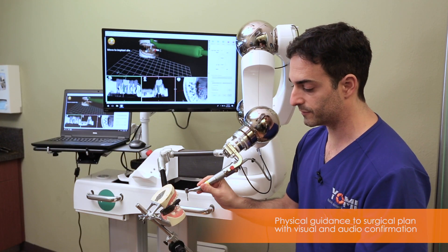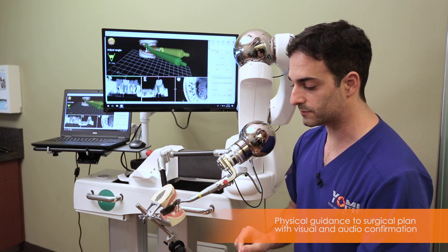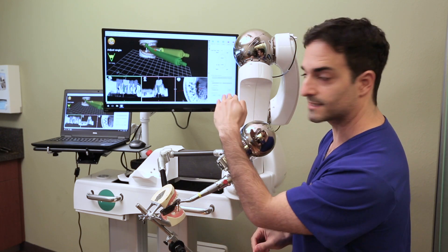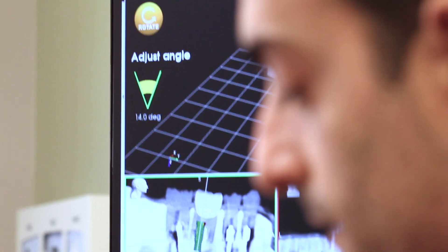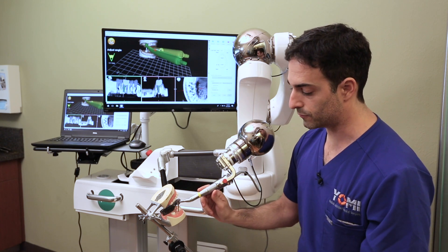As soon as I get within a few millimeters of the surgical site, it's going to stop me and says the angle needs to be corrected to match the plan. On screen it shows me to tilt the handle up, and it shows me my angle error is about 15 degrees off.